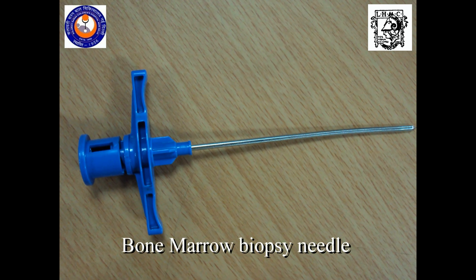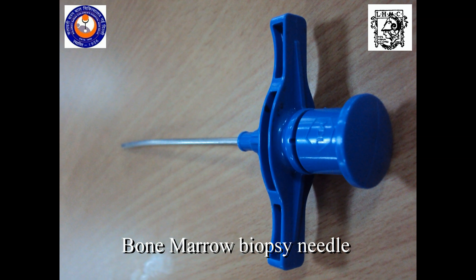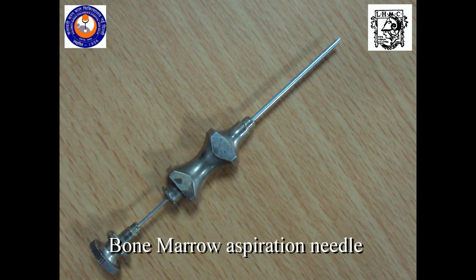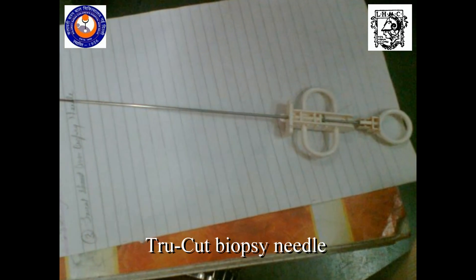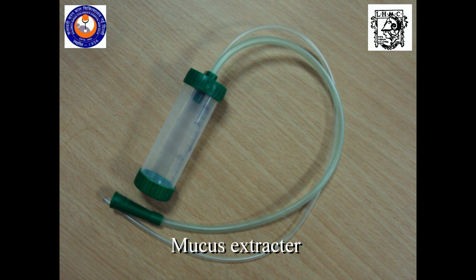Bone marrow biopsy needle, bone marrow aspiration needle, true cut biopsy needle, mucus extractor.